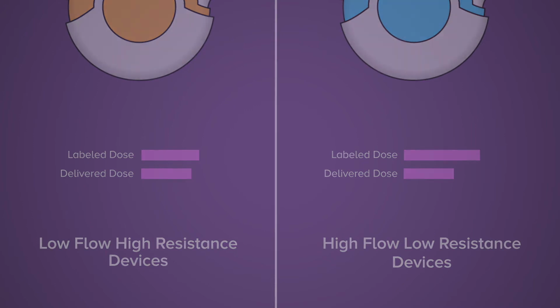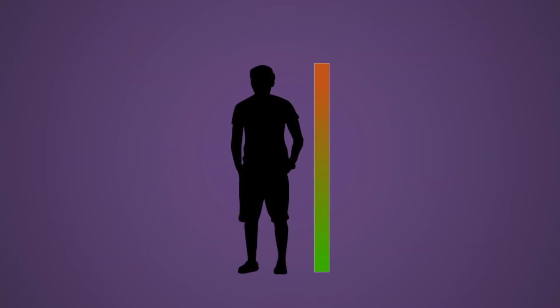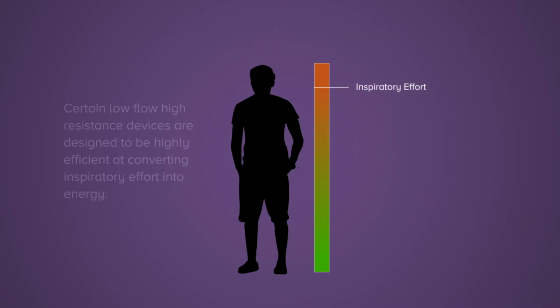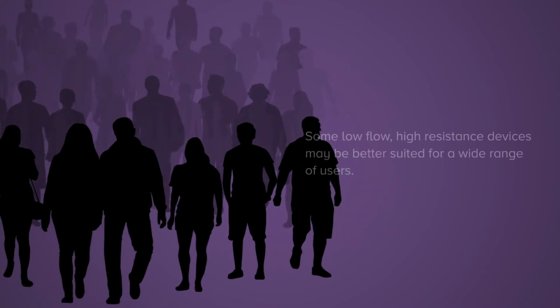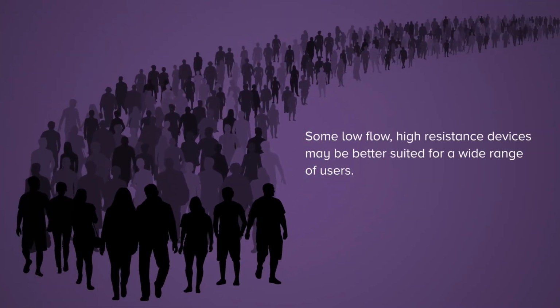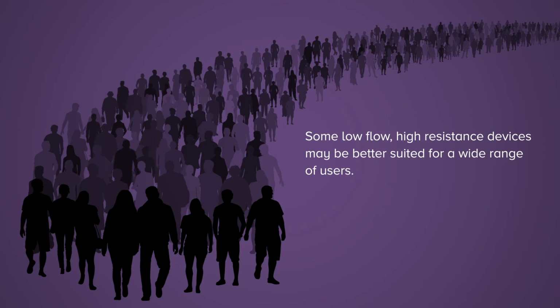It is also important to recognize that higher resistance devices do not necessarily require more inspiratory effort from a patient. In fact, certain low-flow, high-resistance devices are designed to be highly efficient at converting a patient's inspiratory effort into energy, and thus may require lower effort. Thus, some low-flow, high-resistance devices may be better suited for a wide range of users, including those with airflow limitations.